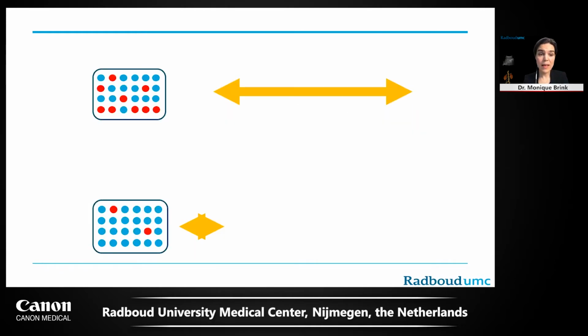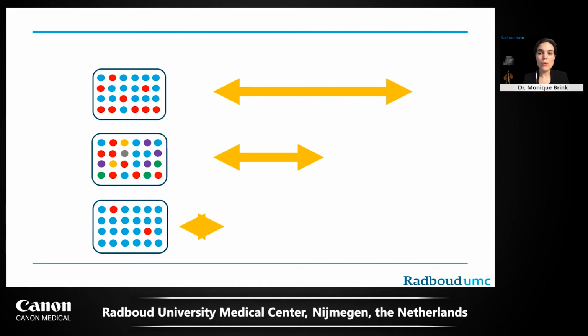So what does this mean? In a triage population, CT works really well. In a screening population, it doesn't. However, using CT scanning as a triage tool is not the cheapest alternative. As we still have PCR available, we have enough material right now, it might make more sense to use the cheapest tests first. And if you're not getting to the solution, you might use CT as the problem solver. And that's how we use CT right now, only as a problem solver.